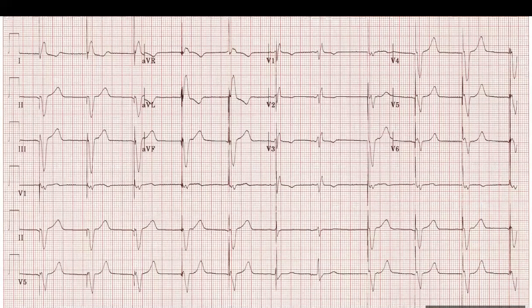The question: what is the atrial rhythm? Because we're talking about an ECG now. So what is the atria doing?